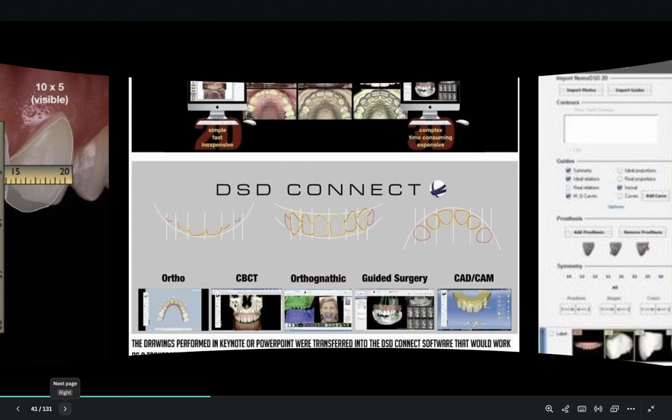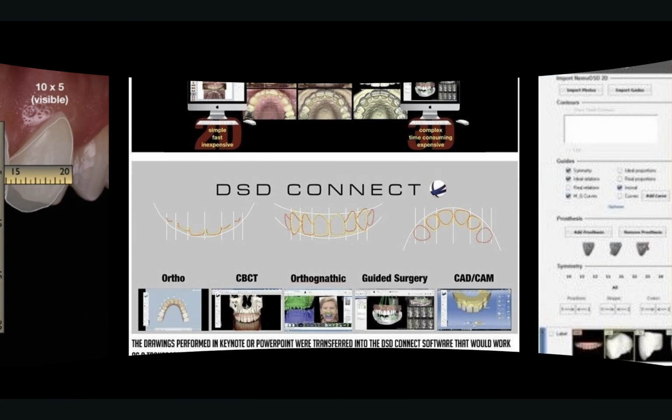We had CBCTs, DICOMs, actually being able to export out of their software and turn those slices into an STL that then could be overlaid with an STL of the actual model. So then you had an even further understanding of the relationships between bone, tooth, and gingiva, and the gingival complex. The ability orthognathically to be able to see in context where in the face things were seated.